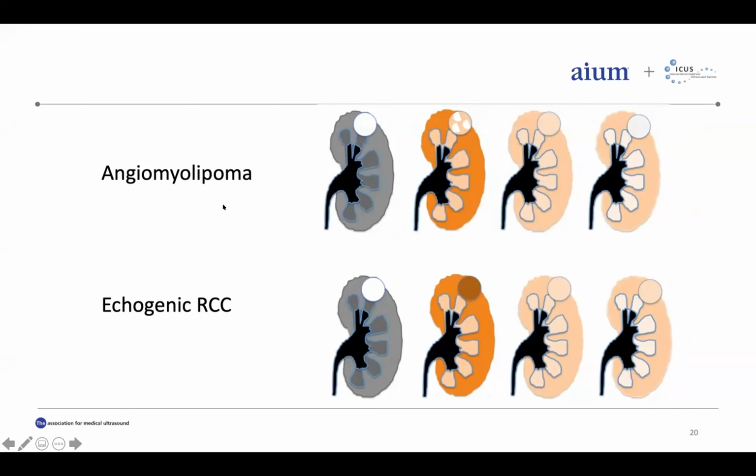Looking at angiomyolipomas versus echogenic renal cell carcinomas. The angiomyolipomas, in our experience, have had enhancement less than the cortex in the arterial phase and often had areas that didn't show much enhancement. They look like a hemangioma would look, partly in the mid-phase where it's heterogeneous.